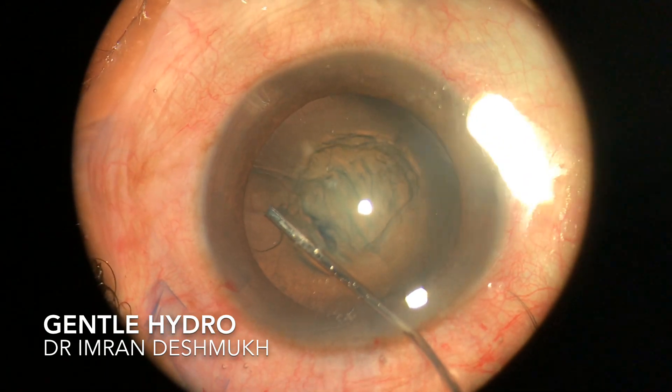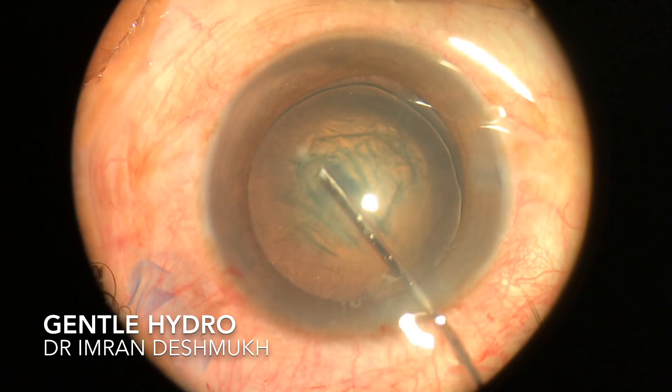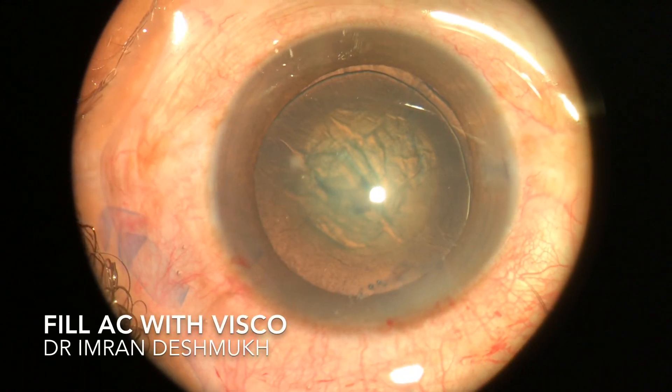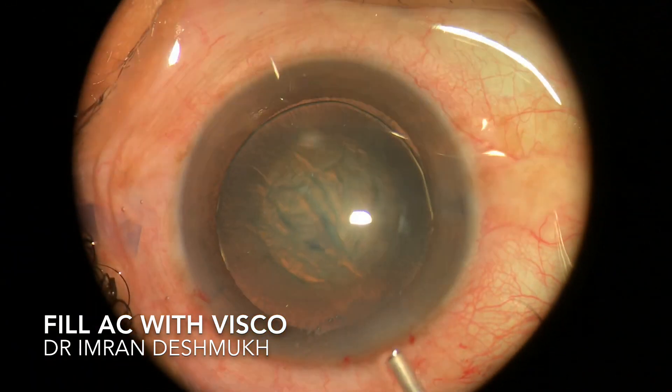Gently do hydro — you can see the wave coming — and then gently tap. You don't want the AC pressure to go very high, so be slow and be steady.